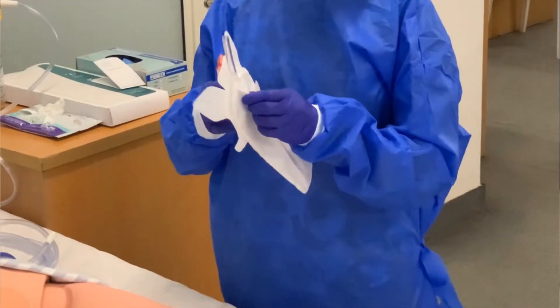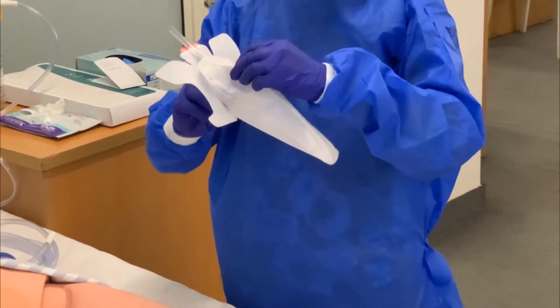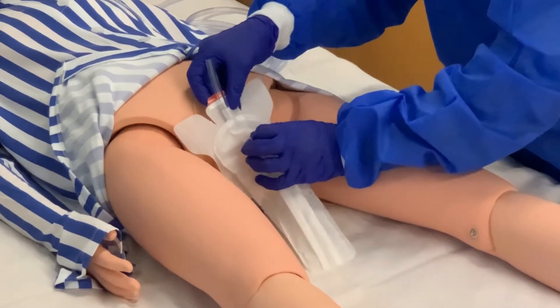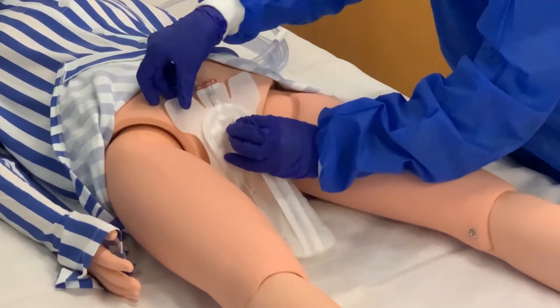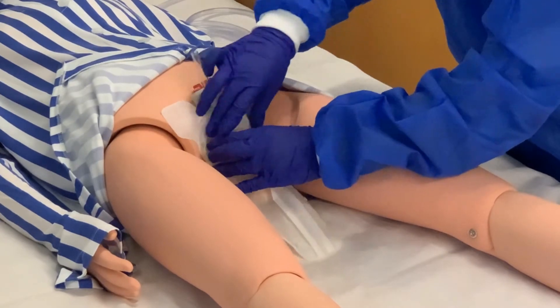Using your dominant hand, hold the pleat on the top layer of the device to create a space within the pouch. With the other hand, hold the penis and push towards the abdomen to get access to the full shaft. Carefully insert the shaft into the opening of the pouch and slide the pouch over until the adhesive patch is flush at the base of the shaft.